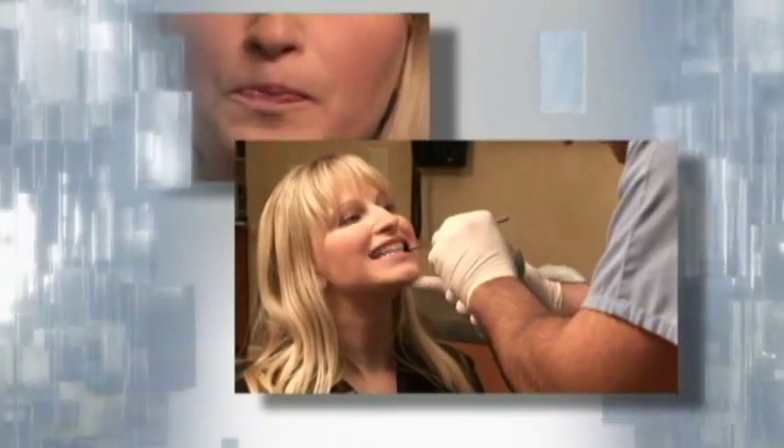Vivera retainers were created to fit the needs of patients' busy lifestyles. The Vivera retention program provides your practice with a cutting-edge treatment option that overcomes the typical barriers to retention and improves patient satisfaction. I'm actually wearing the Vivera retainers right now and nobody knows that I'm wearing them. I really don't think I'm going to have a problem sticking with Vivera over the long term, only because it is so easy to use.